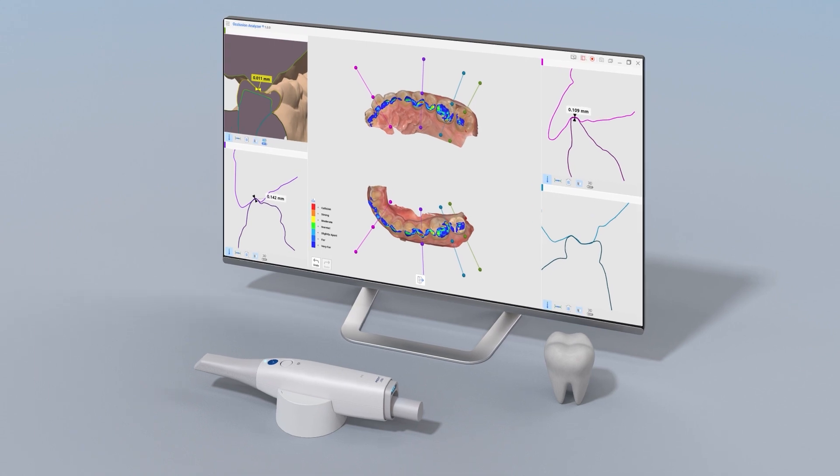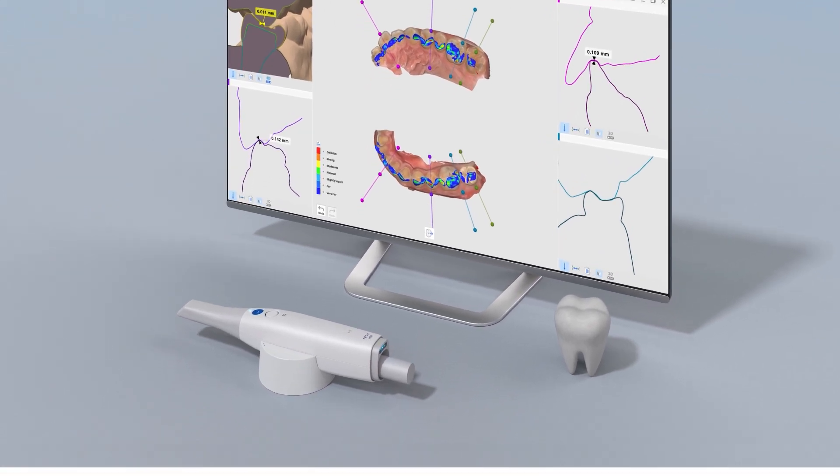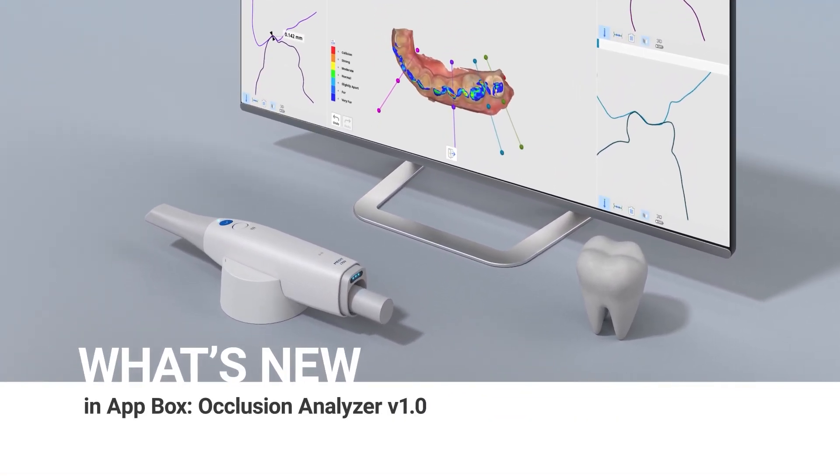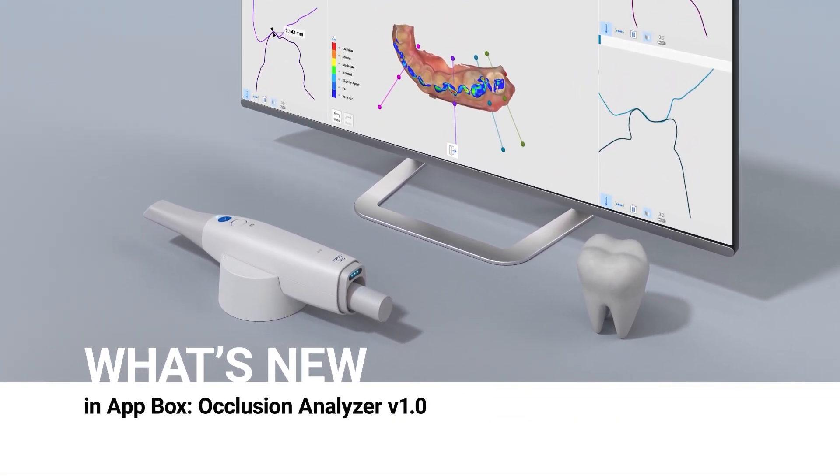And this is just a brief sneak peek into the new app. Get your Medit Occlusion Analyzer from the App Box now and enjoy the new experience.